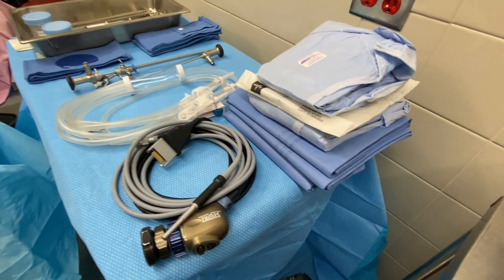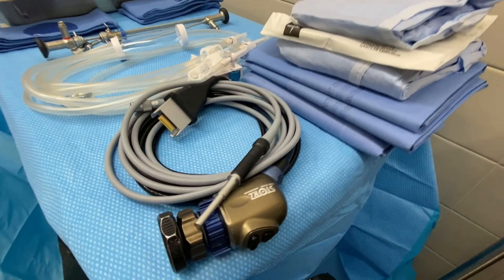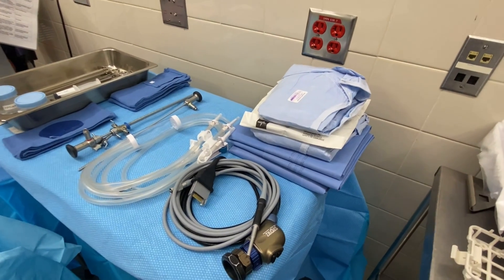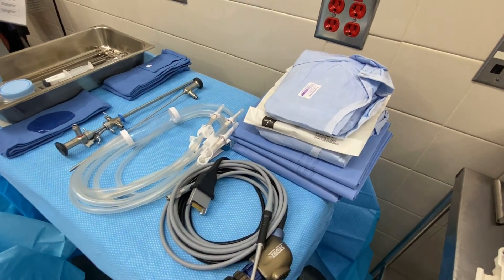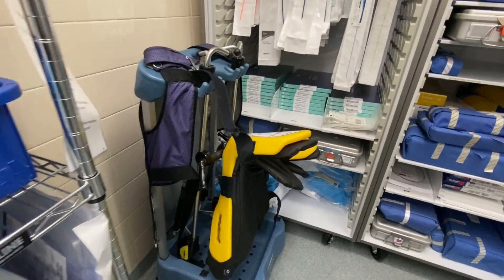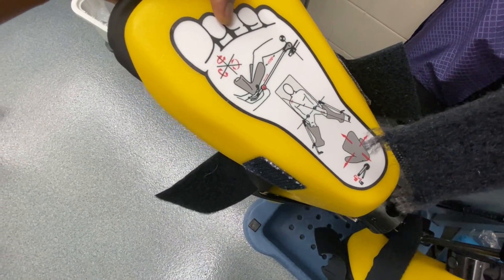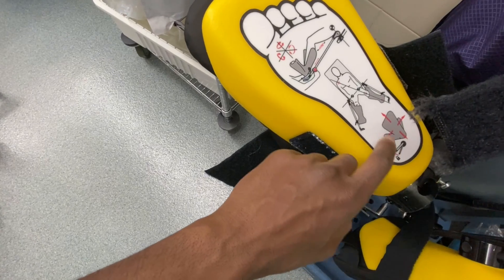Here we have our drapes that come in the pack. Typically you start out with an under-the-butt drape, then you do your leggings — there are two leggings that go above the under-the-butt drape. Then you've got your gown and gloves, one for me and one for the doctor. The leggings will go over our stirrups, which is what the legs rest in. You can see a good demonstration right there of what the patient will look like, with the stirrups going over the legs.